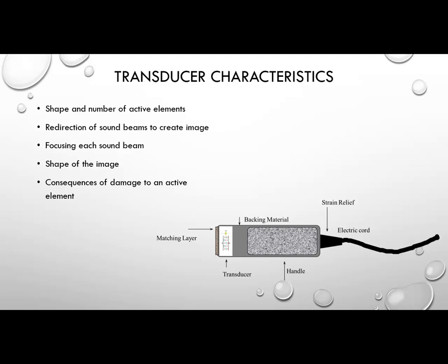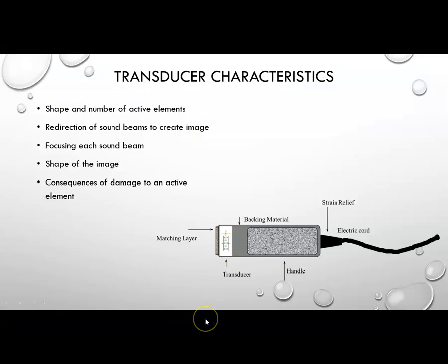All transducers we use today are what we call phased array transducers. Any transducer other than a phased array transducer probably would be a single crystal transducer that we used to use, a mechanical transducer. With phased array transducers, so getting back to the ones that we use today, the image is created by small timing delays going to the little subcrystals in the transducer head.